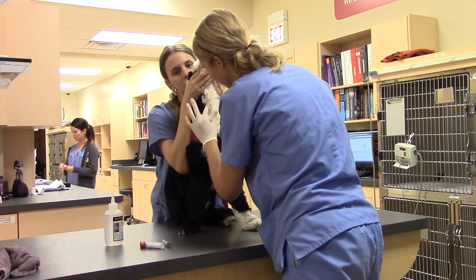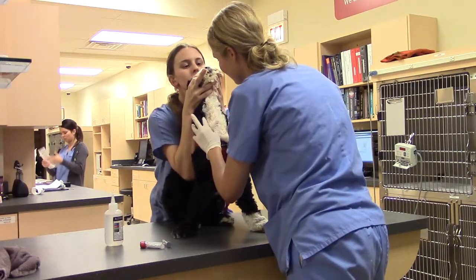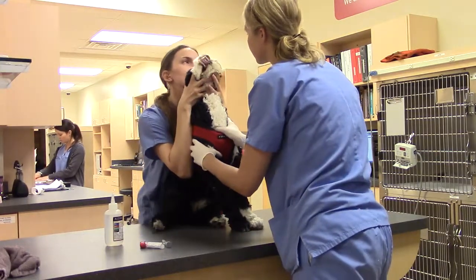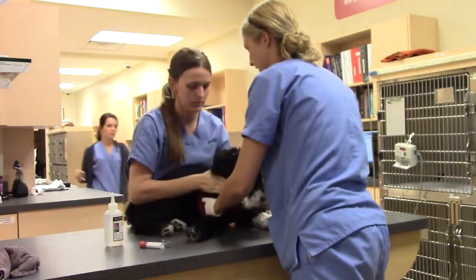There it is. So after I've palpated again, I'm going to go ahead and poke. Hey Bianca, do you want to help just hold her legs?